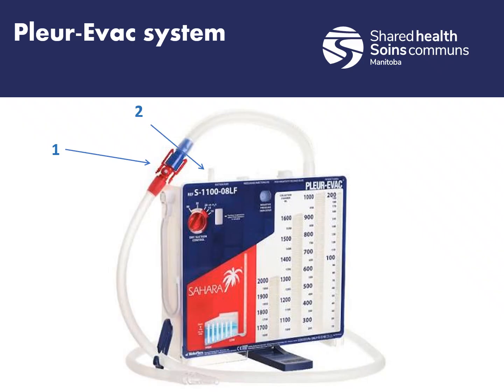If suction is required, you're going to connect the suction to this port at the top here. Suction may not always be used on these devices. You may just use air, normal room air. But if you need to apply suction, you would just take this and attach it here on the top.